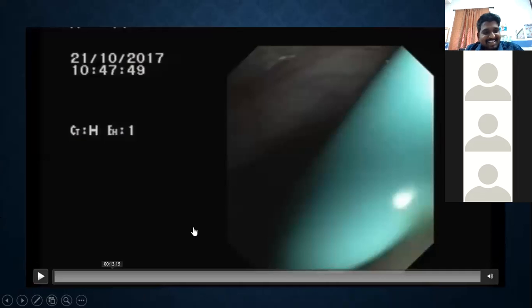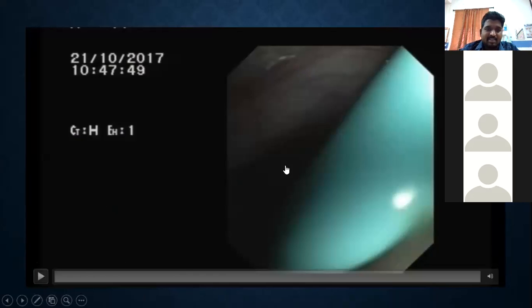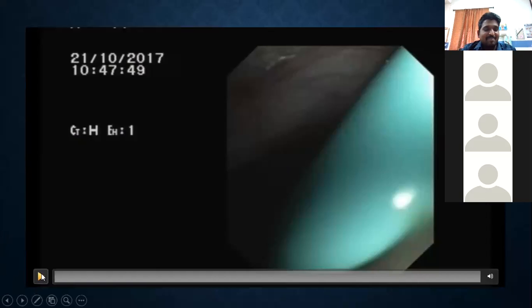And this is one more case of an interpleural foreign body. Actually, it's iatrogenic. This was a pneumothorax. For the pneumothorax, they put a pigtail catheter. After removing the pigtail catheter, during the time of discharge, a piece of the pigtail catheter fell into the pleural space, and they discharged the patient with the pigtail catheter piece in the pleural space. So the patient came with the pneumothorax and with the pigtail catheter inside. I was very shocked. And then here is a picture.